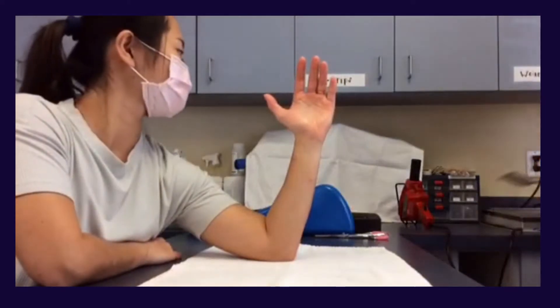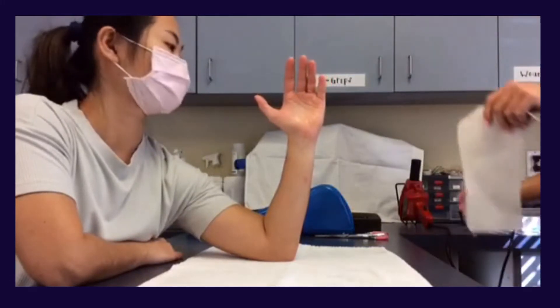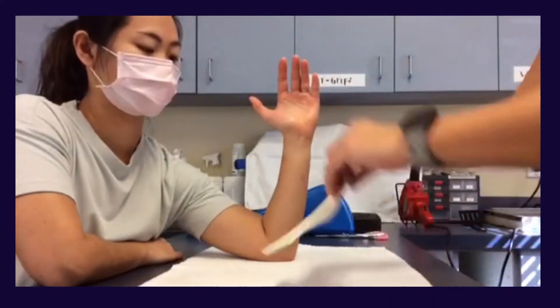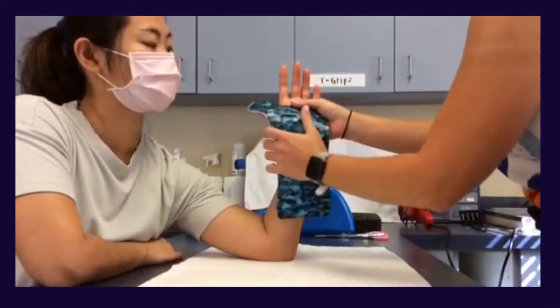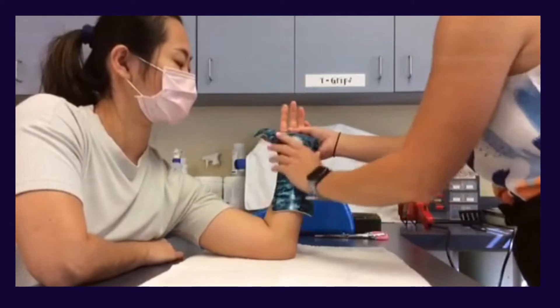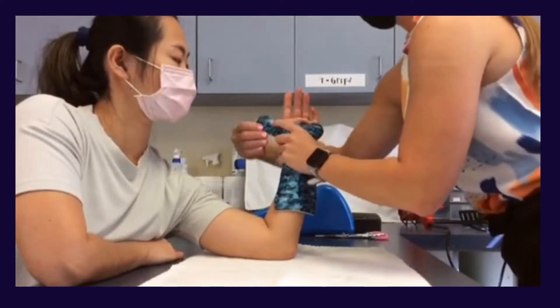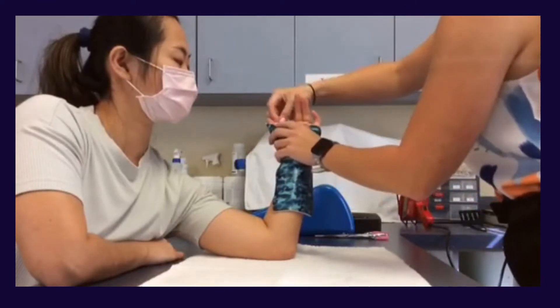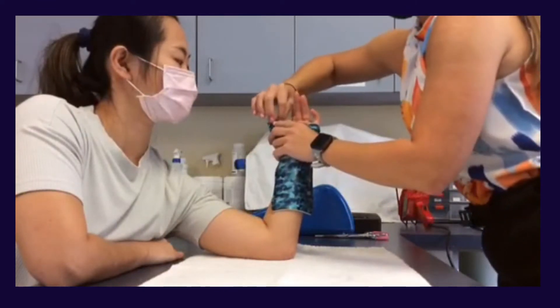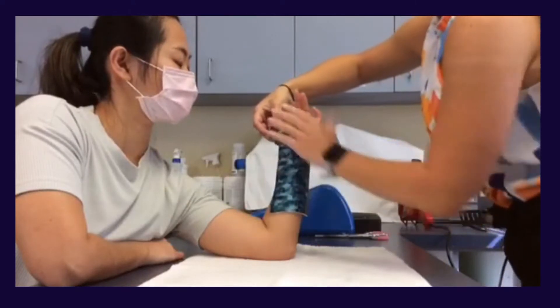While fabricating the orthosis, let gravity assist you and place the patient's forearm into supination. This will make your life a lot easier while fabricating the orthosis. Make sure the thumb MP joint is blocked and fully supported before anything else. This is the most important part of the orthosis, so you want to make sure it fits properly and the thumb has enough support. You then can use your palm and the web space of your hand to smooth out the rest of the orthosis along the forearm.